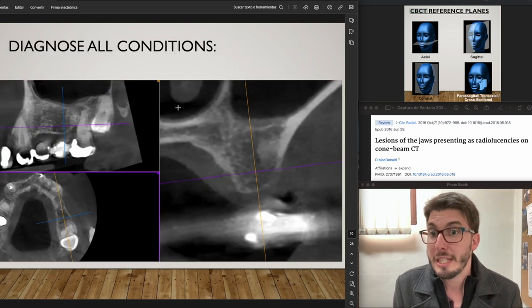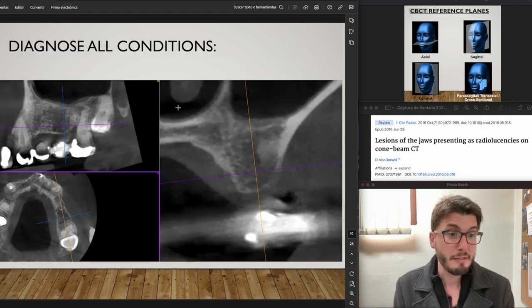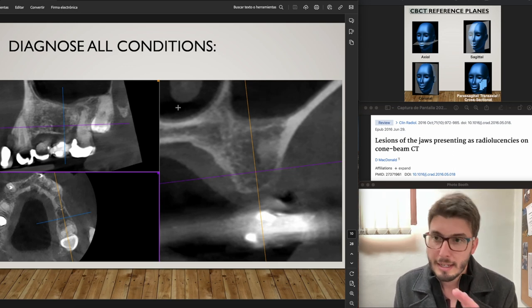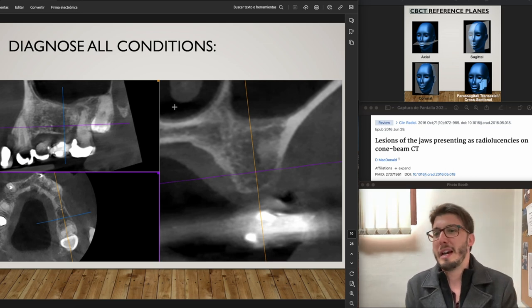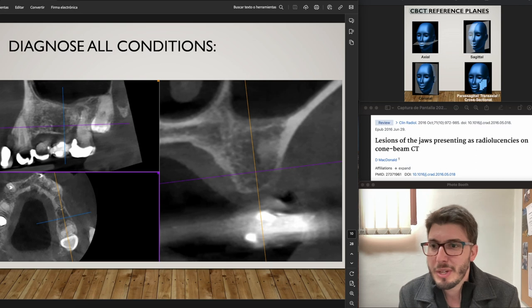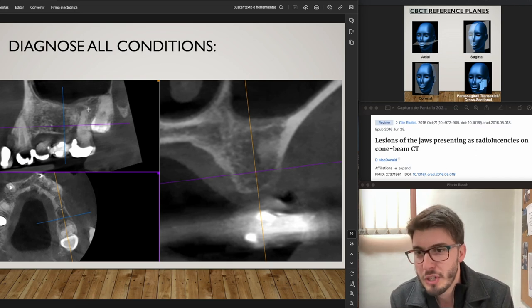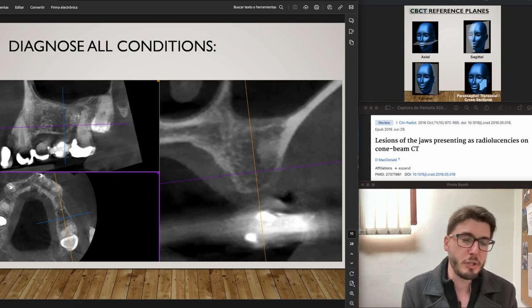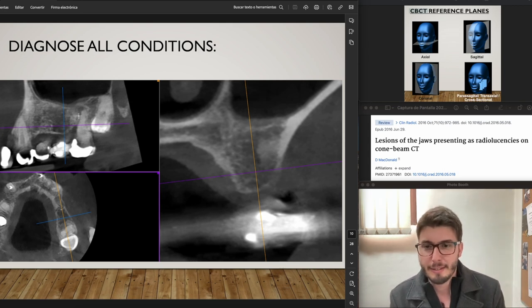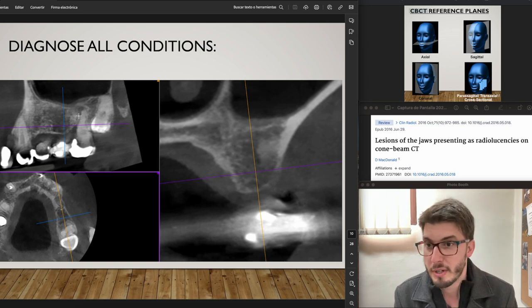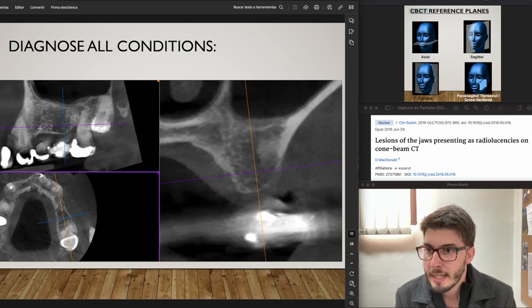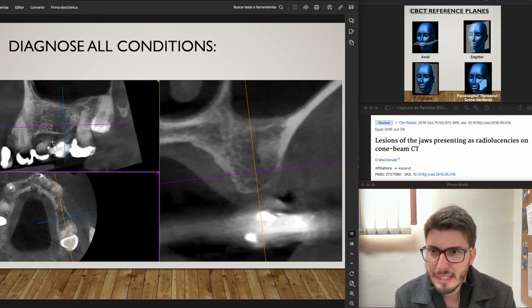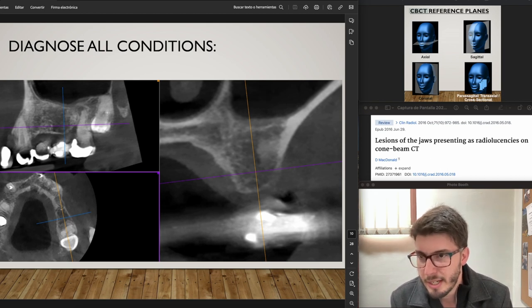Please feel free to pause the video and diagnose all conditions of this image. We have here a hypodense image suggestive of periapical granuloma — of course, you know it's suggestive because the definitive diagnosis would be biopsy. Then there are areas with bone sclerosis, a vertical bone defect, and an impacted third molar.